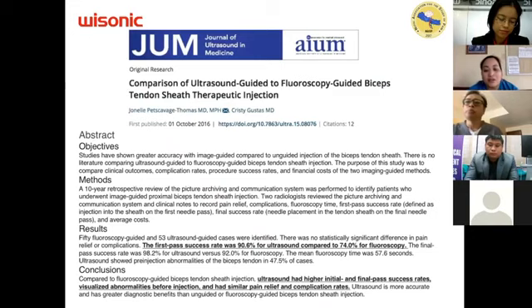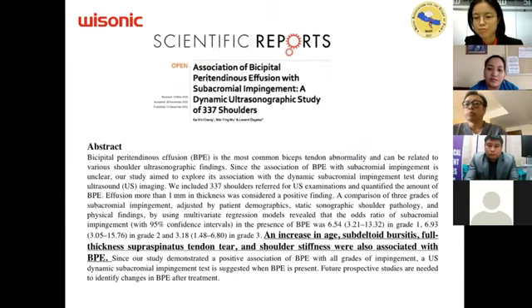They found that with ultrasound, the first pass success rate was 90.6% compared to 74% for fluoroscopy. Ultrasound guidance also helped visualize the abnormality before injection to make a better diagnosis. But both techniques had similar pain relief and similar complication rate.